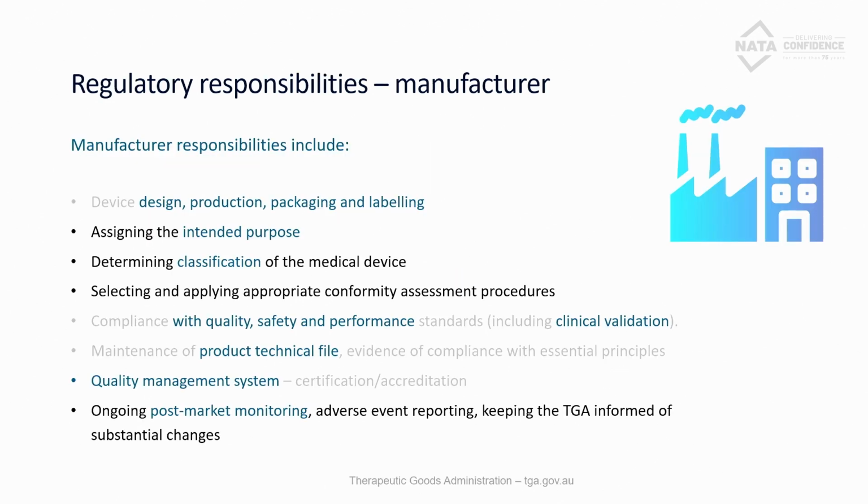Some of the other functions of a medical device manufacturer, they're responsible for the design, the production, packaging and labelling of the product. They determine the risk classification, which in turn determines the conformity assessment procedure to be applied. They're responsible for maintaining the product technical file and providing all of that information, notifying of any substantial changes to the product, and also the post-market monitoring.